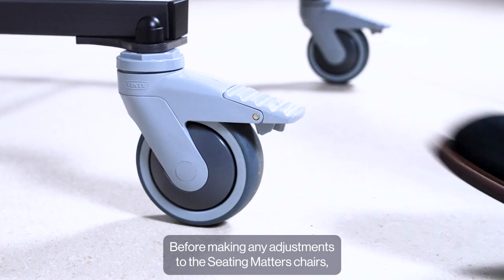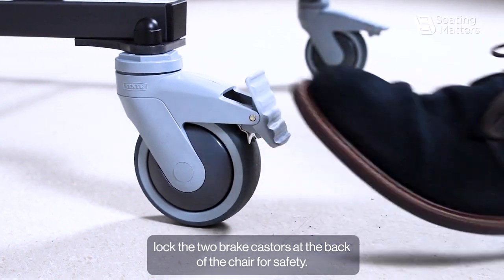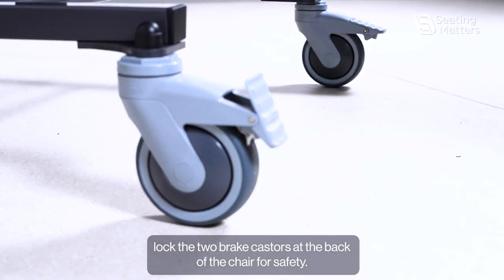Before making any adjustments to the Seating Matters chairs, lock the two brake casters at the back of the chair for safety.